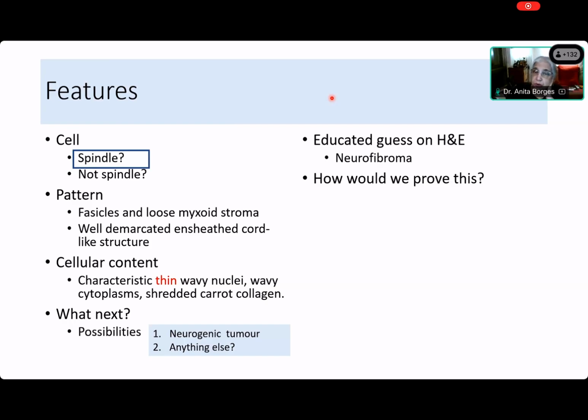Good. Now, how would we prove this? Yeah, Kedar? The four iconic IHCs, ma'am. Oh, really? Firstly, I don't think we need to. We don't do IHCs just for the sake of doing IHCs. There is only one diagnosis. Even if you thought it was a schwannoma, there is no way that you would be able with your four IHCs to distinguish a schwannoma from a neurofibroma.